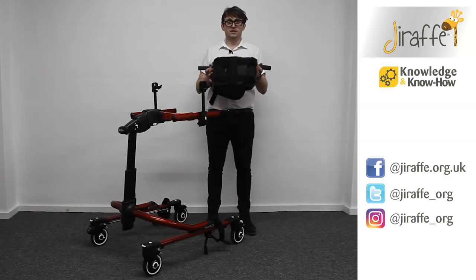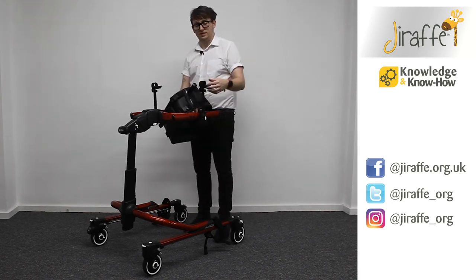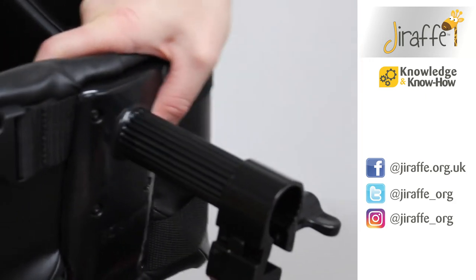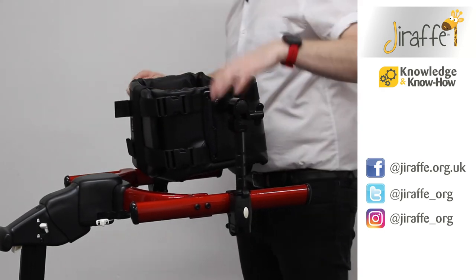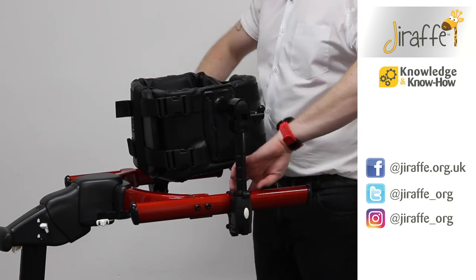We're now going to fit the chest prompt into place. Make sure that the wing knobs on the fittings are nice and loose, and then we're going to place the chest prompt through the fittings. Remember that if we needed the chest prompt to become more narrow, we can swap the clamps the other way.